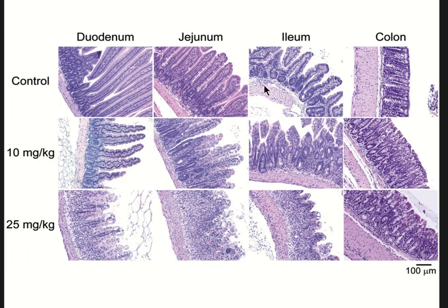This is a great side-by-side view of parts of the small intestine versus the large intestine. You can definitely tell the difference from the colon with the rest of them because there's just way, way, way more goblet cells. No villus, right? Almost looks like a fuzzy layer here. However, will you be expected to know the difference given slides like this at the bottom row between the duodenum and jejunum, or between the jejunum and the ileum?